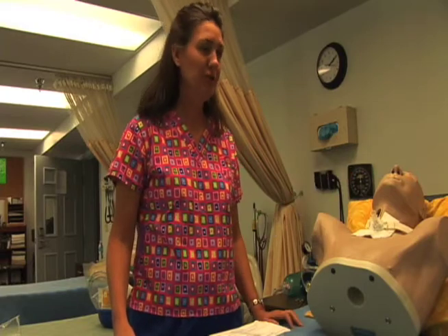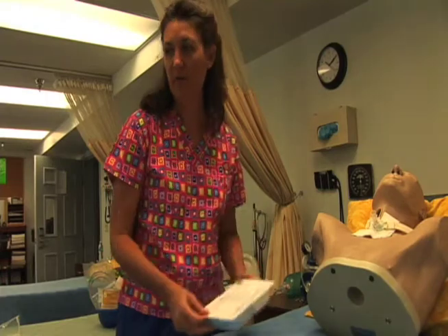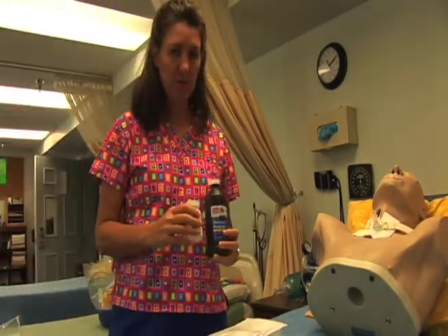I'm going to demonstrate to you today how to do trach care cleaning. After you suction your patient, you will get your trach care tray out, get your hydrogen peroxide and your sterile water.